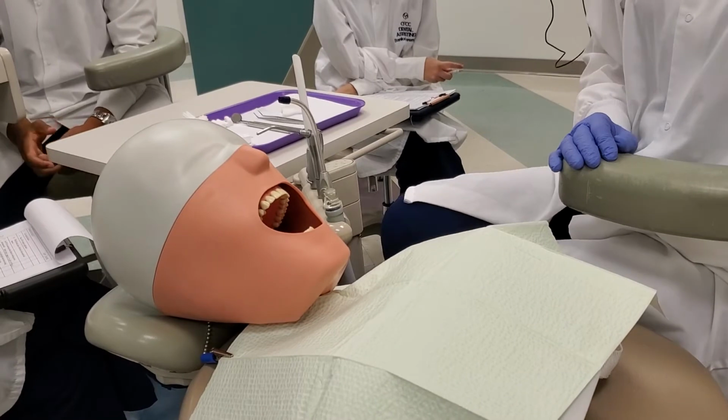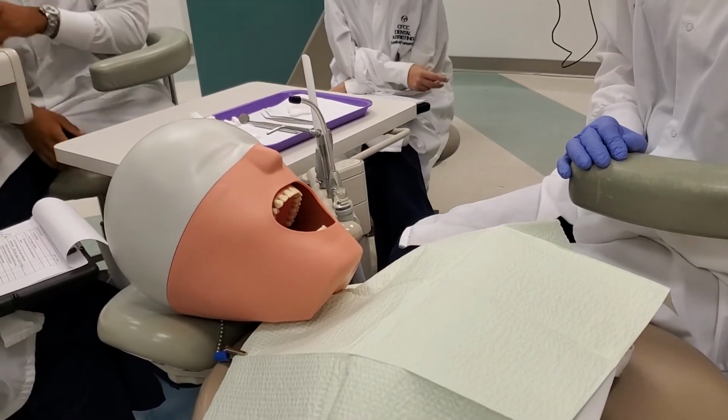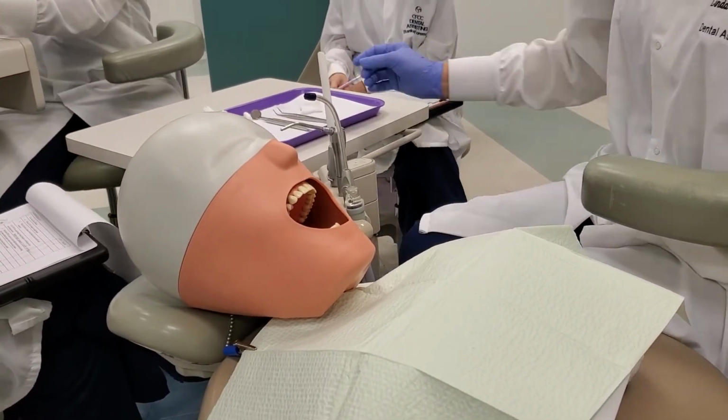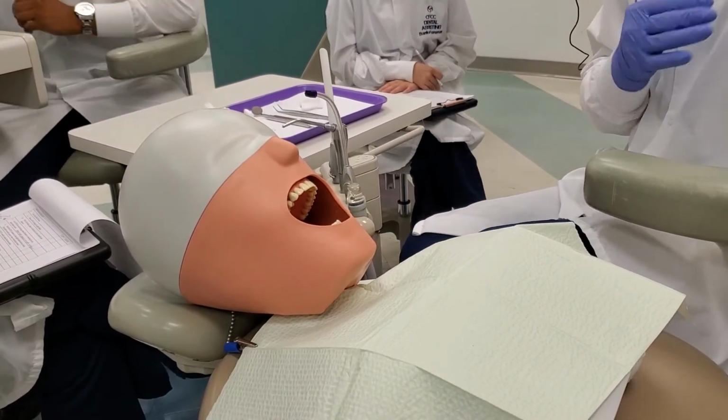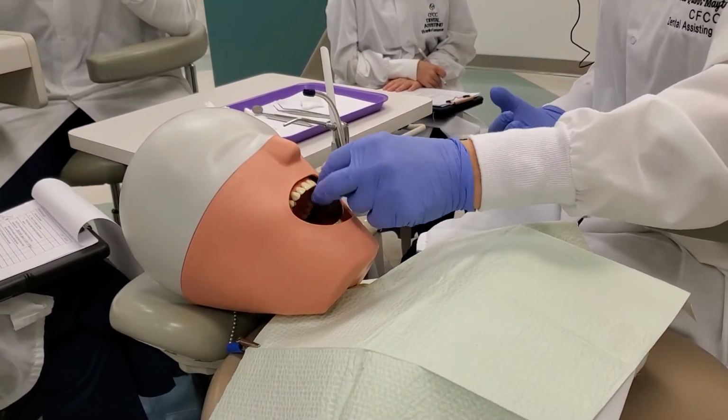Now we're going to go into the absorbents, number 6. Place a dry angle over the Stenson's duct. Again, this is where I really hope that we do get to work on a patient, because this will not stick on his cheek.